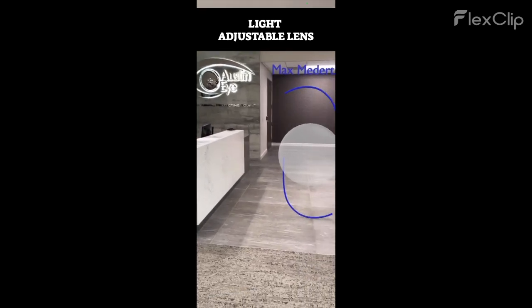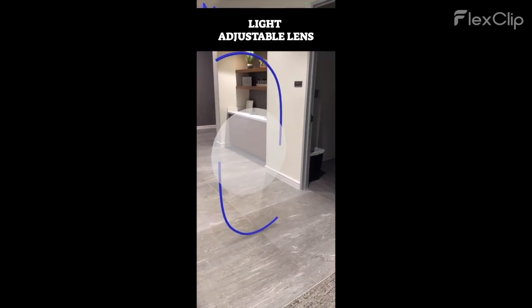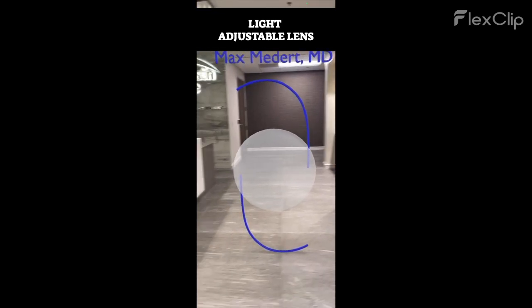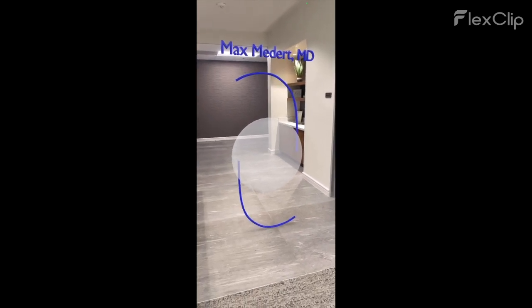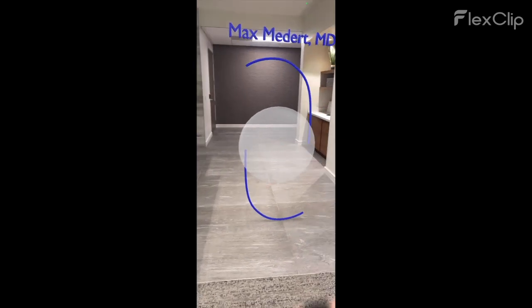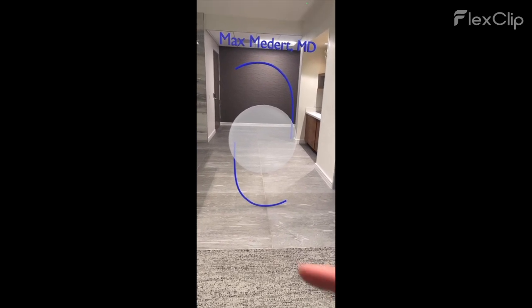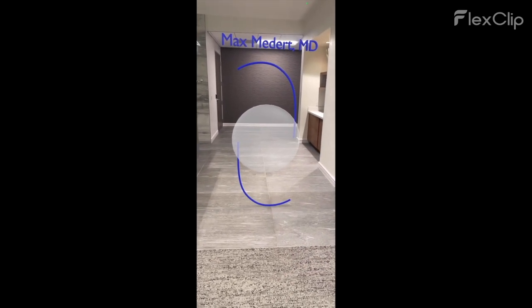We're here in the Austin Eye preoperative area, and look who I found. This is a light adjustable lens. If you've been watching my other videos, you'll notice it looks completely different than the Odyssey and the Clearview 3. First of all, the haptic design — this is a classic three-piece design with a different material for the haptics compared to the optic. The optic itself is kind of simplistic; it's made of silicone instead of acrylic, and has none of the rings or segmented bifocal features we saw in the other lenses.